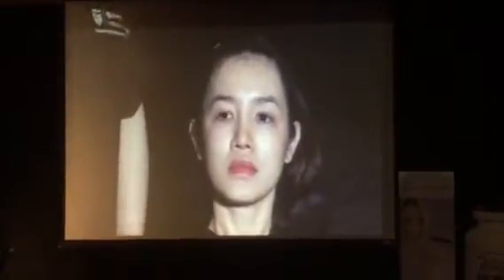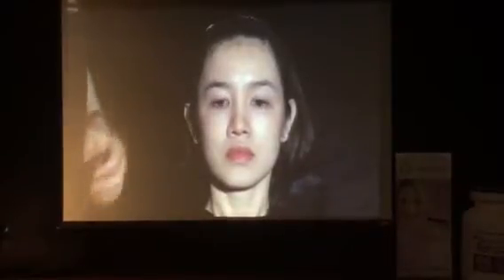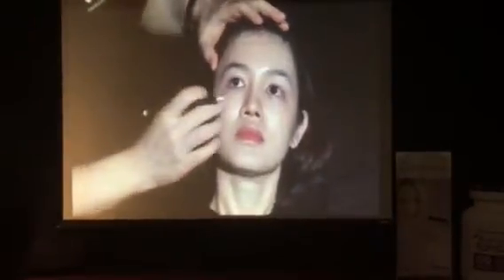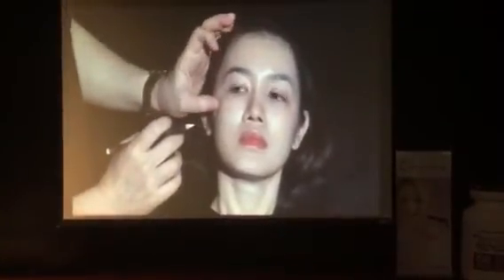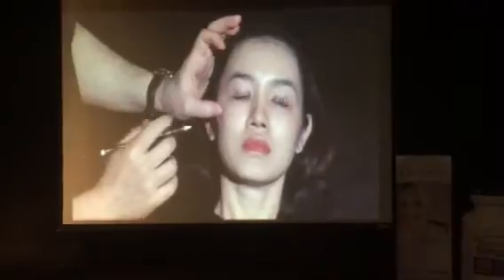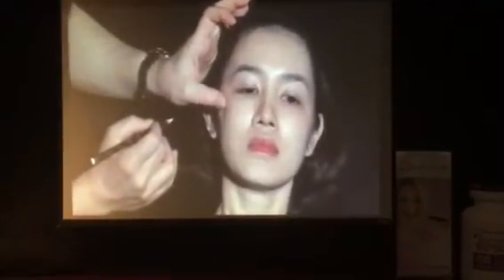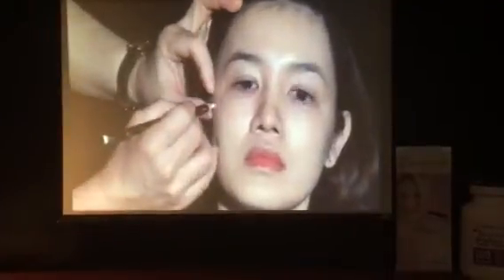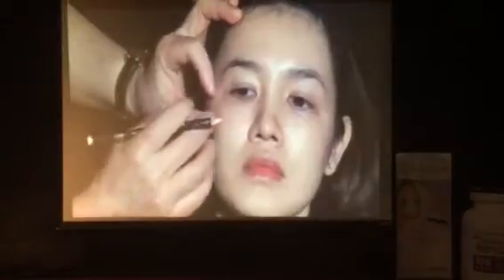Is anyone of you familiar with the 8-point lift? That's also in your book. In today's book, you can take a look at the 8-point lift. If I do the 8-point lift, I usually start like this. The first point is L1. L1 is the suture line, so it's here. This is what we call L1.